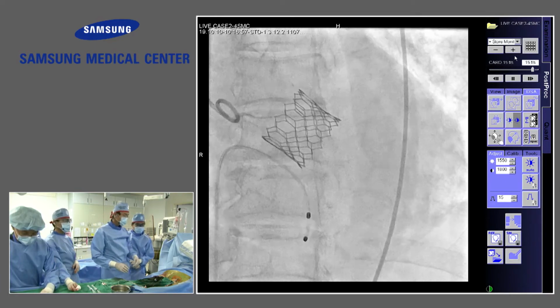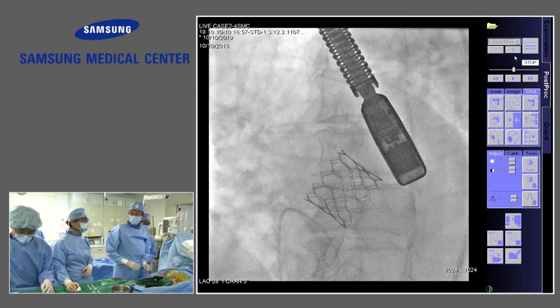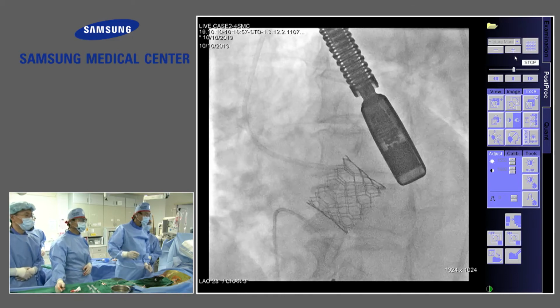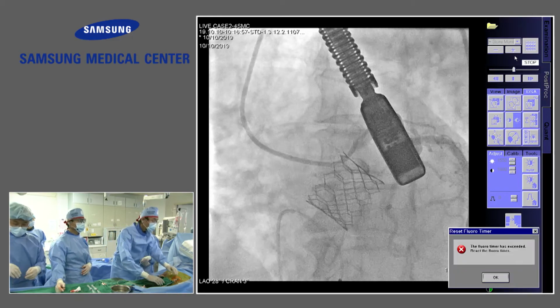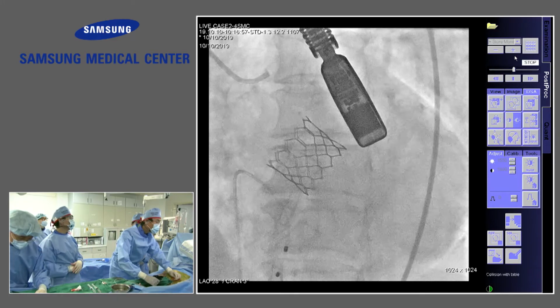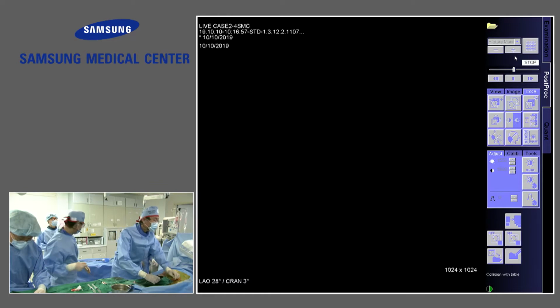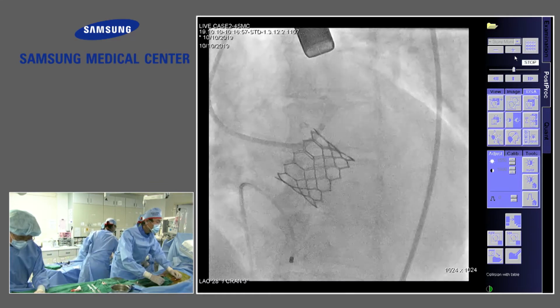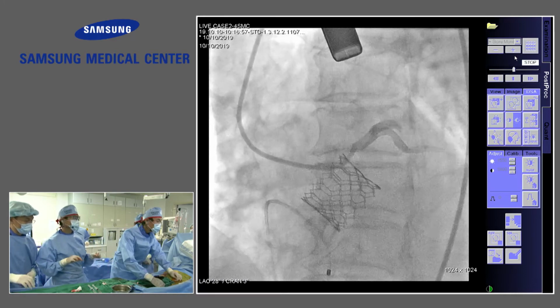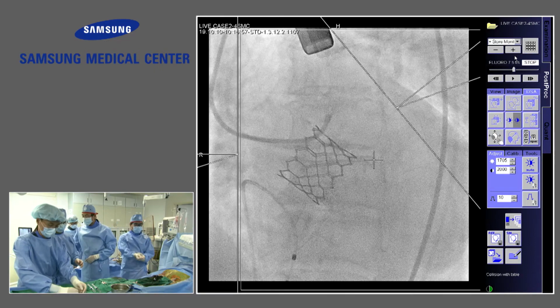Now I'd like to ask the question about the LAD lesion. Oh, you will try that also? Okay, perfect. Please show it. Let me cut the wire back and try again. Very interesting. Please show us the FFR value of the LAD. Real educational. FFR specialist, Dr. Park.